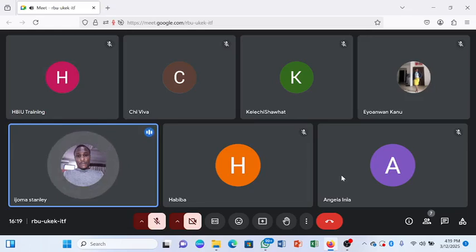Then we talked about the blood bank, where we discussed that you use the red cap bottle or even the EDTA, the purple cap bottle, to take blood samples for the blood bank, and the importance of proper labeling of blood collected at the blood bank, proper testing and labeling. We mentioned the very few things that could happen in the course of blood transfusion, which to an extent is outside the scope of our discussion.